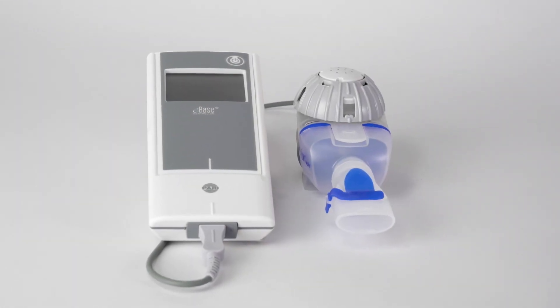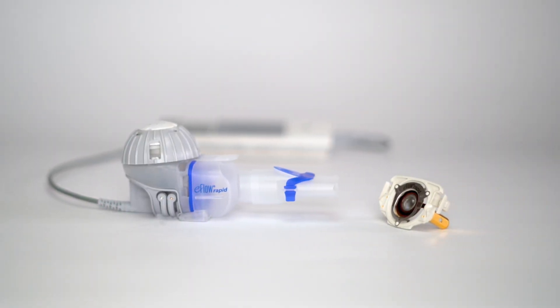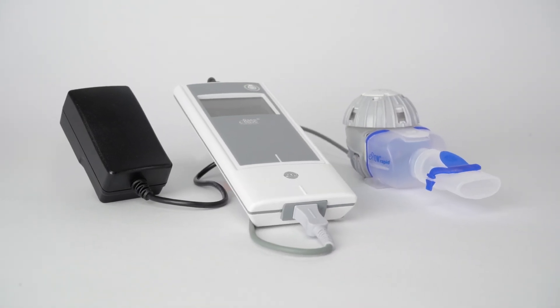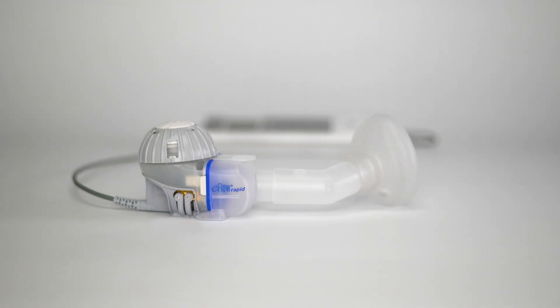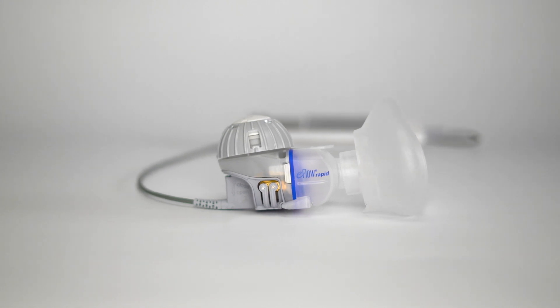It consists of an eBase controller, an eFlow Rapid Nebulizer handset with mouthpiece and aerosol head, a connection cord and a power adapter. Further options are the Smart Mask Baby with Bend, the Smart Mask Kids for children from 2 years old, and the Smart Mask for Adults.